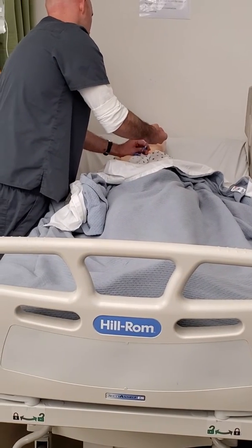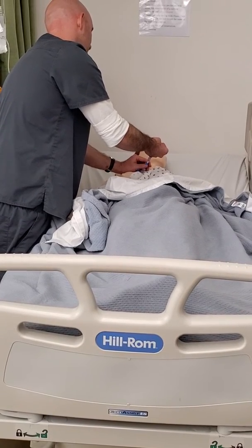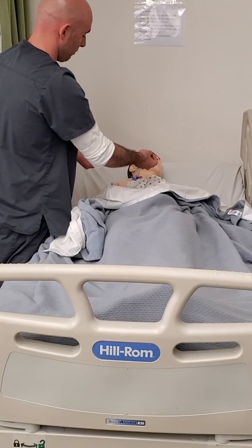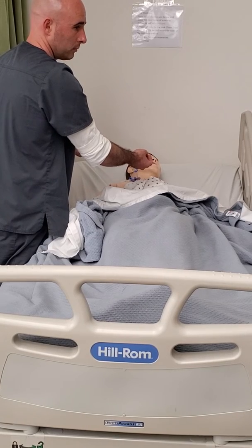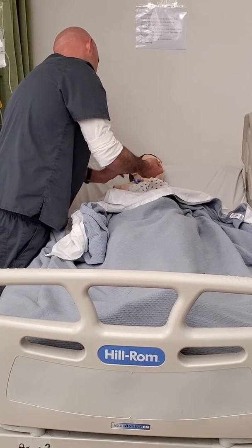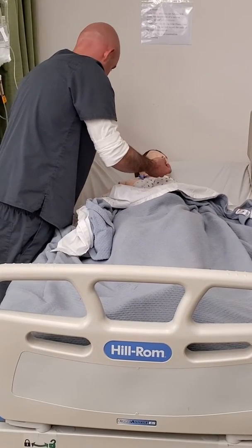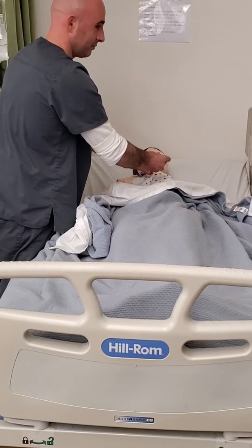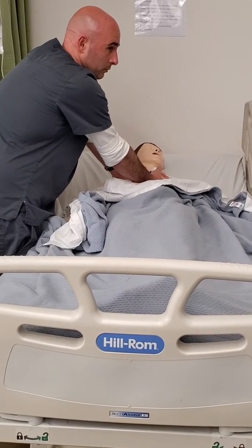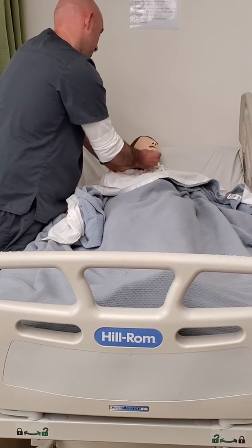Why are you keeping positive pressure on the syringe? So that no air is getting in there. Where would the air come from? Air wouldn't come from anywhere. I don't know. To prevent backflow. Yeah, backflow. You've cleaned out the lumen of that catheter, and now when you're done, if you keep positive pressure, it prevents blood from coming up into the tip of that catheter and clotting it off. Okay, now we know.